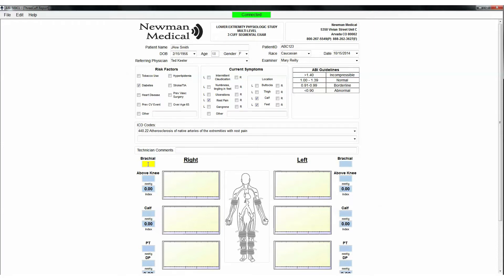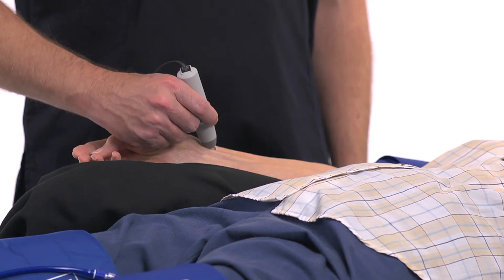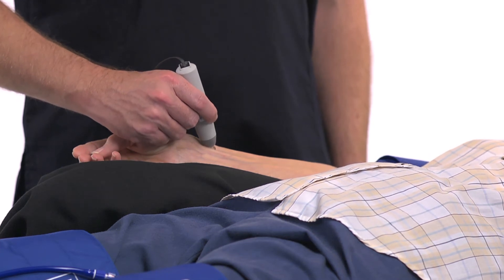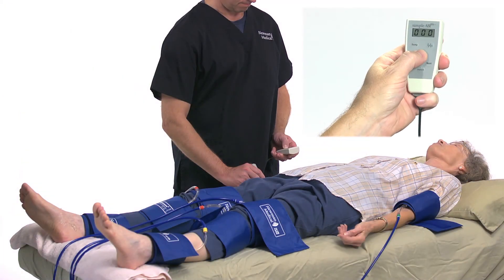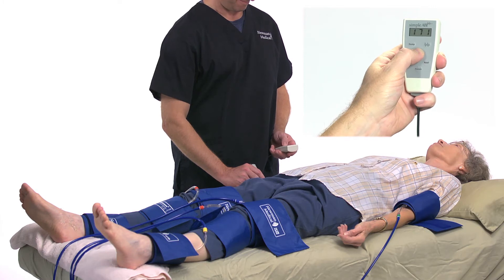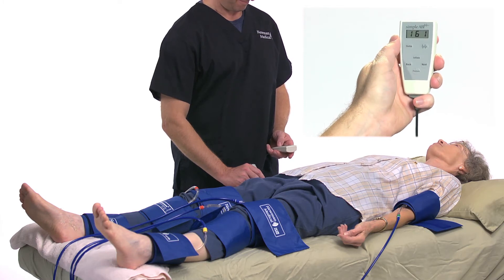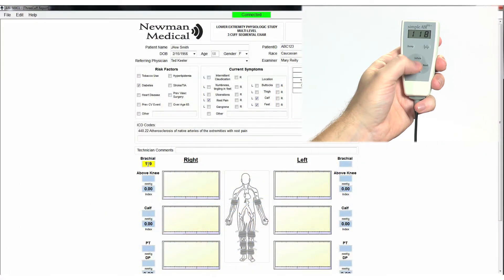Use the computer cursor and click on the right brachial field. Place the Doppler probe at an angle to the skin over the radial artery, moving the probe slowly back and forth until the strongest arterial signal is heard. Press and hold Inflate on the cuff link remote and inflate the cuff until you no longer hear the signal, then continue for an additional 20 mm. Release the Inflate button and the cuff will automatically start to slowly deflate. When you hear the Doppler signal return, press the Pressure button and the pressure will be entered in the right brachial field. If you want to repeat the pressure, just repeat the process and the new pressure will replace the previous one.